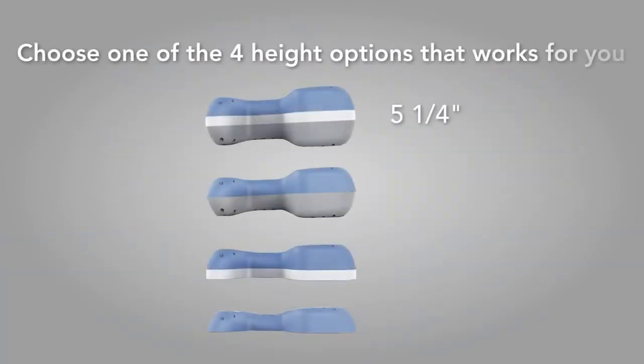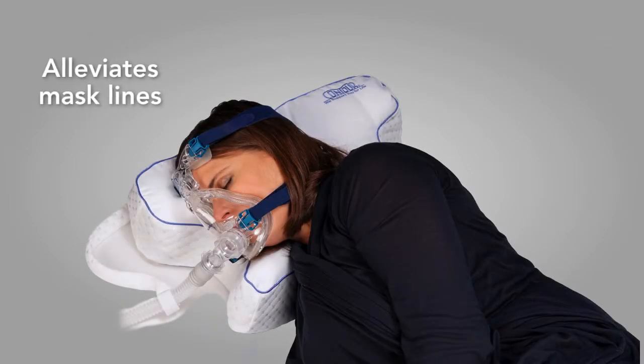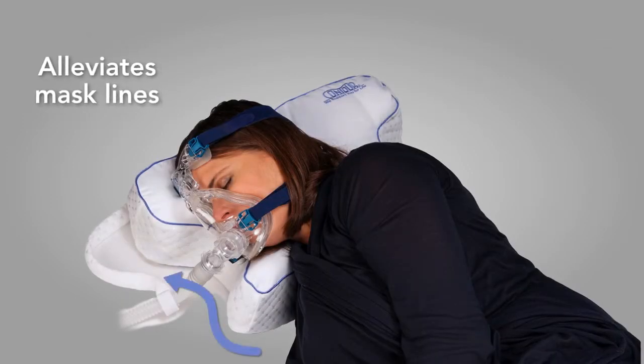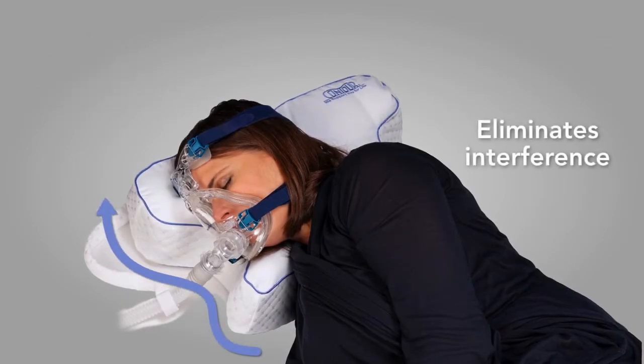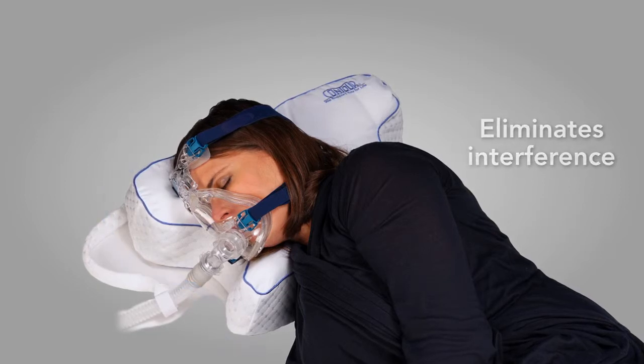Choose one of the four height options that work best for you. The side cutouts are designed to alleviate mask lines and eliminate interference while resting on your side.